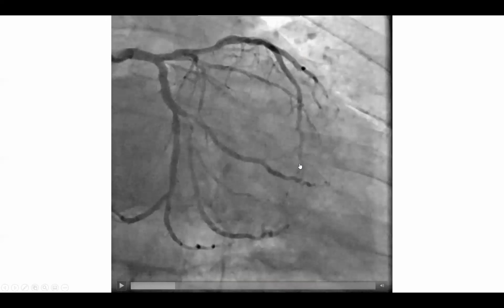It's just that putting two stents in those cases is not going to improve long-term outcomes. You don't want to just balloon one of them, but guess what? Putting 2 stents is associated with a higher risk of restenosis than if you're putting 1 stent across that. So that's why the provisional approach still applies. It's a different animal putting 2 stents in terms of restenosis and MACE.